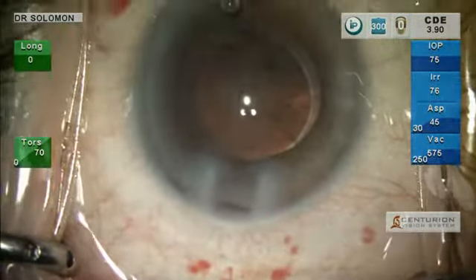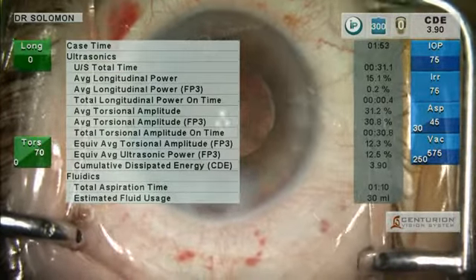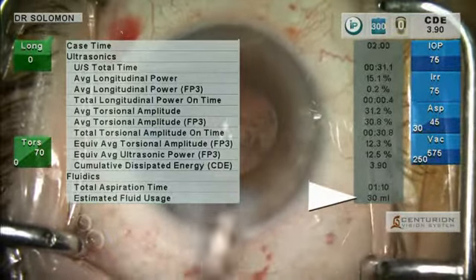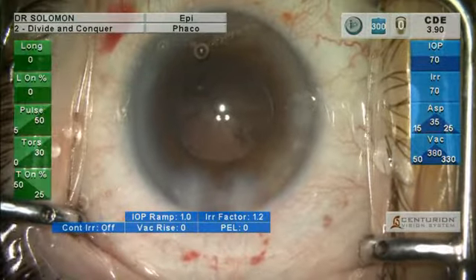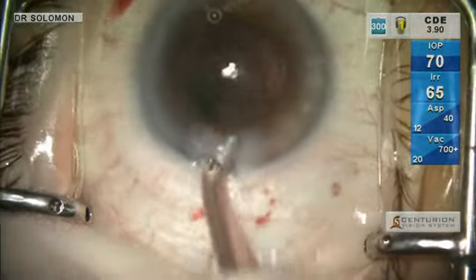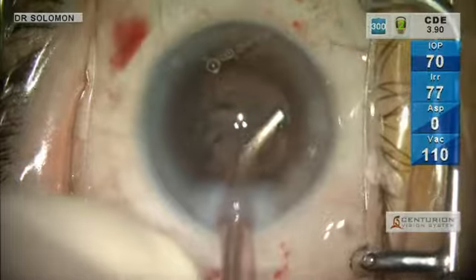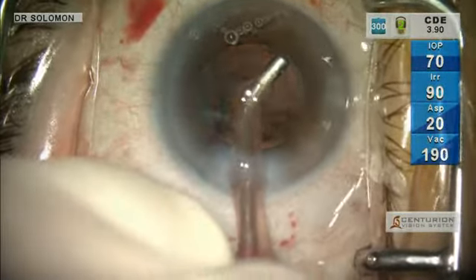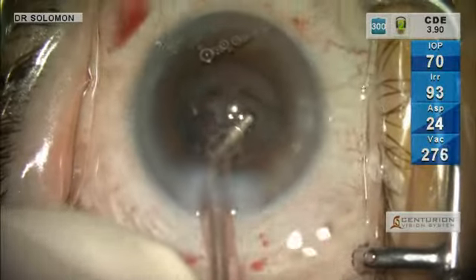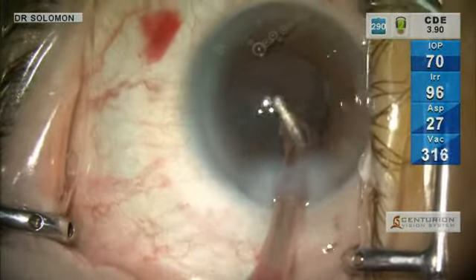We're done — very efficient. The material stays right at the tip, and because the lens has been pre-chopped into this matrix pattern, I'm really not getting a lot of clogging. Our CD was 3.9 and we only used 30 cc's of fluid. With higher parameters — 650-plus of vacuum and 42 to 45 cc's of flow — I had a CD below 4 with very little fluid in the eye. Very efficient system, very stable chamber, taking advantage of the fluidics of the Centurion and the lens pre-chop with the matrix pattern from the femtosecond laser.